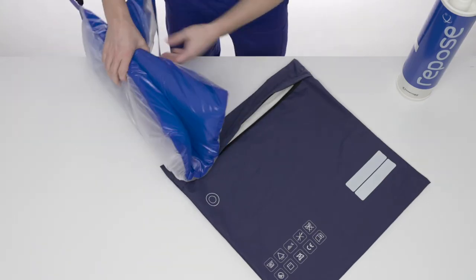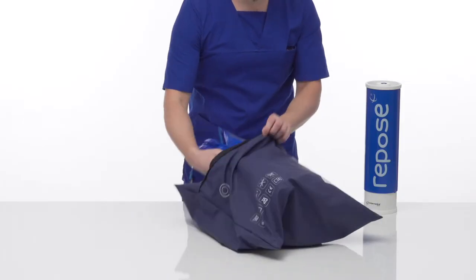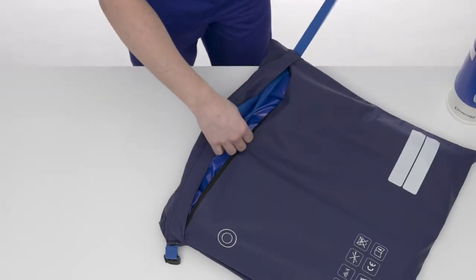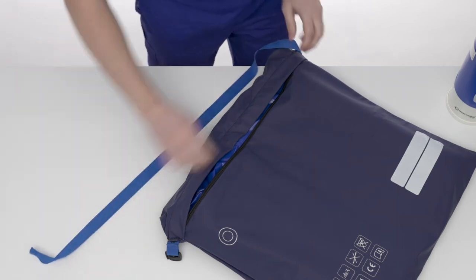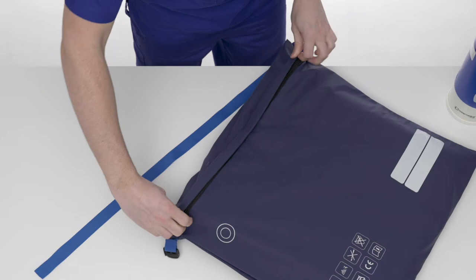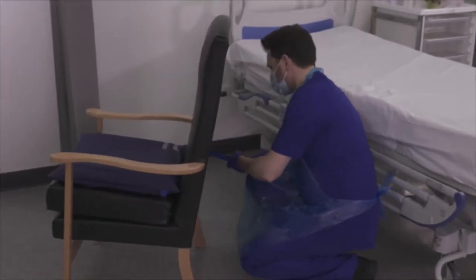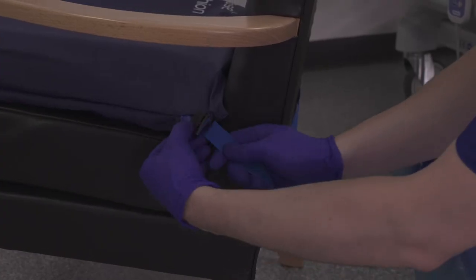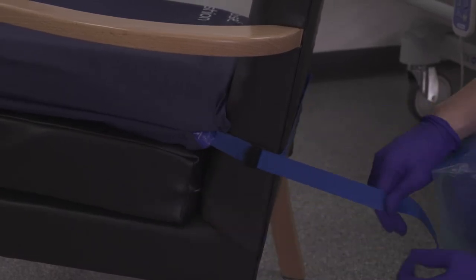If using Repose with a polyurethane cover, insert Repose lengthways into the cover. Thread the straps through the openings in the cover. Close the cover zip and ensure the zip flap is in place. Position on the chair, ensuring that the valve faces down and away from the patient. Secure in place with the integrated retaining straps and use the securing strap around the back of the chair.